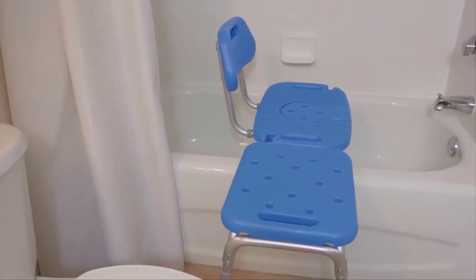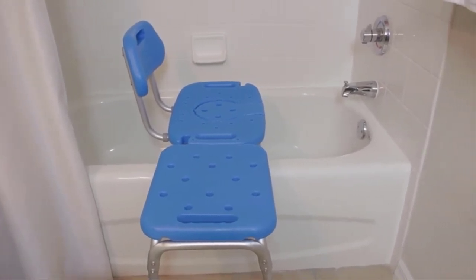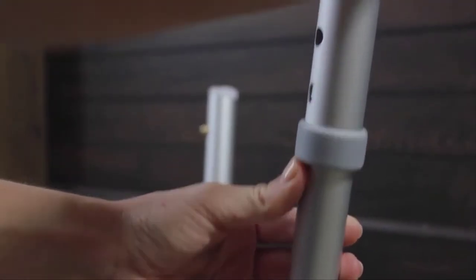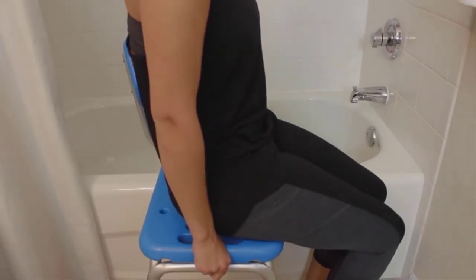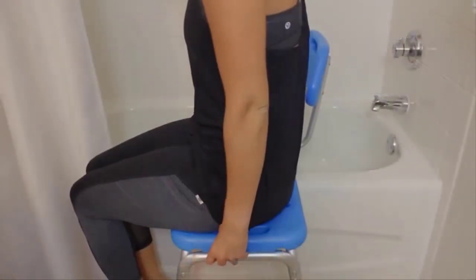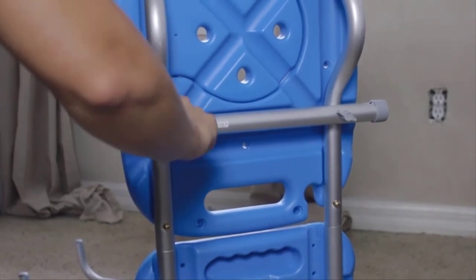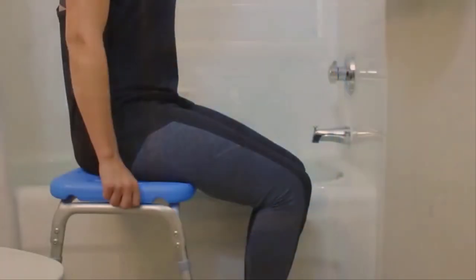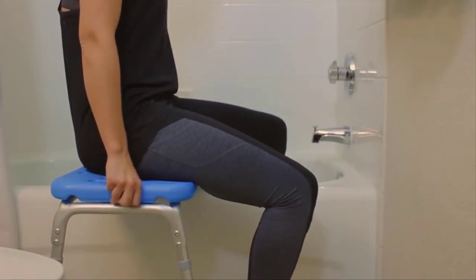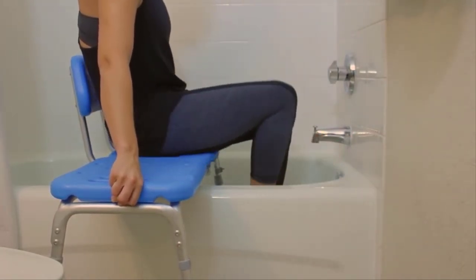The All Access's space-saving design allows it to easily integrate with most tubs and showers. The adjustable height legs mean that the seat height can be perfectly customized to the needs of the user. It is completely reversible and will work for both right side and left side access. The simple, tool-less assembly means the All Access can be completely set up in less than three minutes. Once installed, users can easily transfer into and out of the tub or shower by moving across the bench.